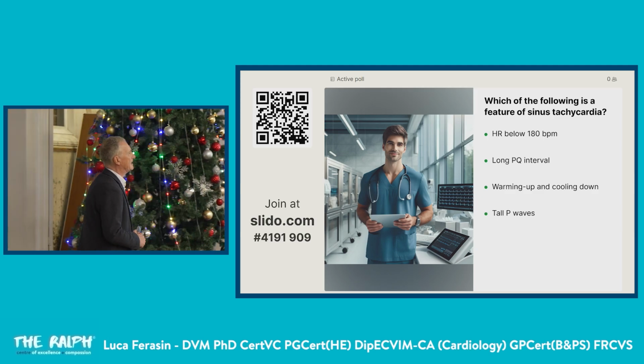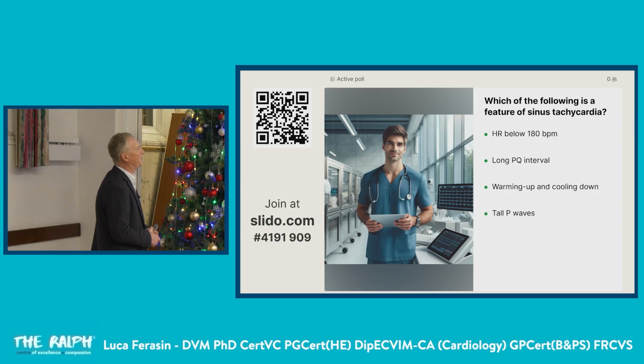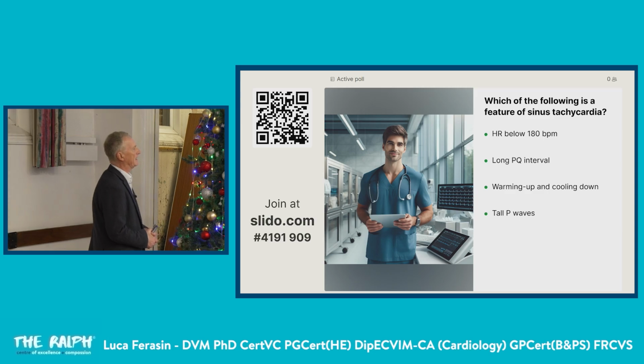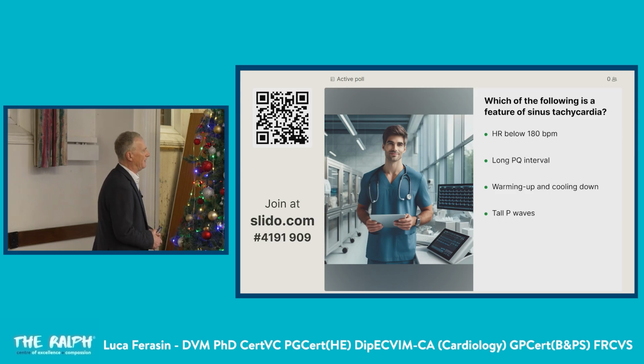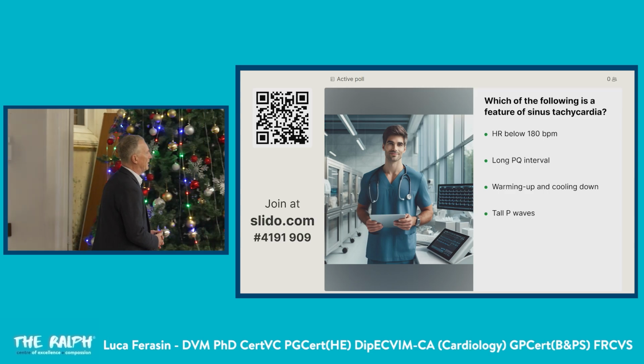Right, now let's start with sinus tachycardia. Which of the following is a feature of sinus tachycardia? It's a heart rate below 180, a long PQ interval, a warming up and cooling down, meaning the heart rate goes up and down, or the presence of tall P waves.